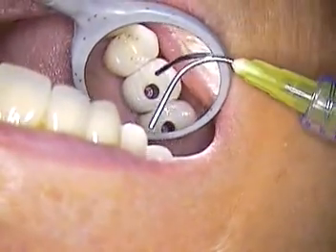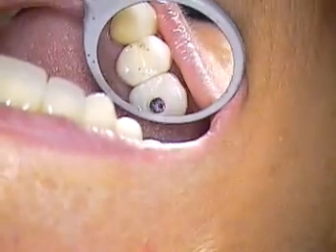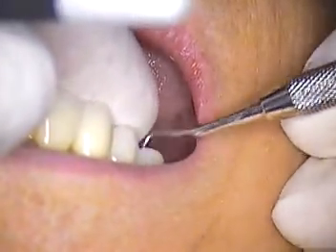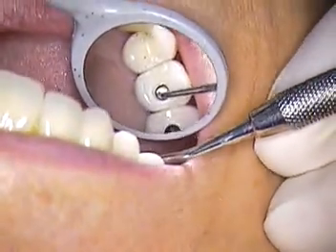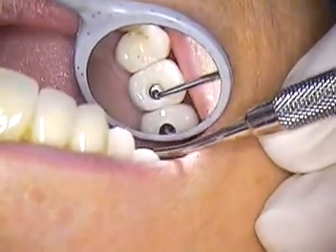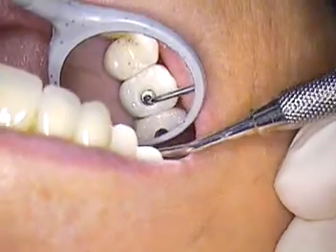Jen, my assistant, is waiting for me to get going. Let's go, finish the case. So here we go — we're going to apply our Teflon tape next, and here's the first batch going in. For you non-dentists out there, this is a method of placing a fail-safe in the case, just to make sure if we ever had to take these off for any reason, we could do that without any effort.